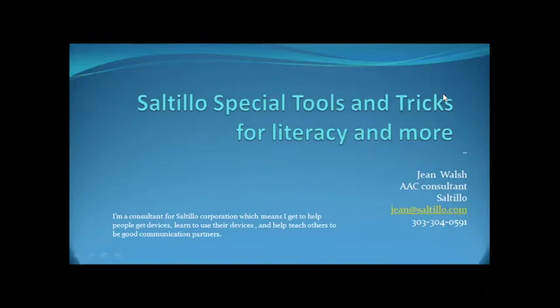Ready? Okay. So, hi, my name's Jean Walsh, and I'm going to talk to you a little bit today about Saltillo, the special tools and tricks that we've developed in the Word Power files for literacy and more.